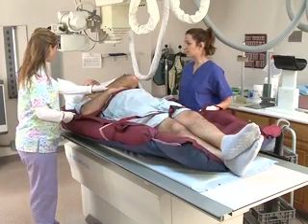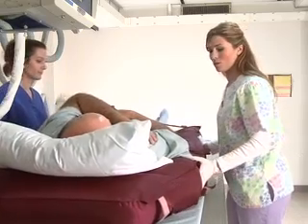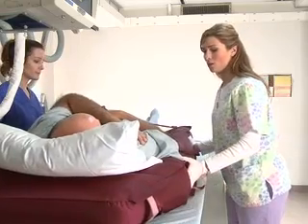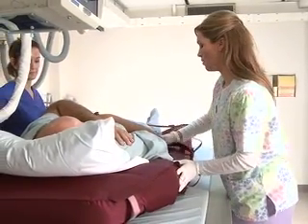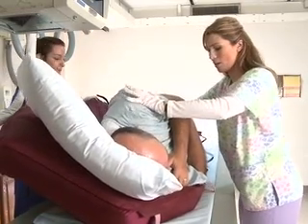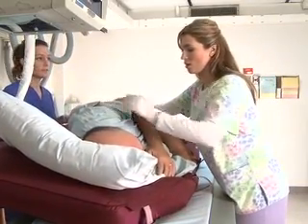The first step to the turning process requires the HoverMatt to be moved laterally away from the side to which they are turning. To do this, the caregiver on the side to which the patient will be turned uses an open-handed technique to push the HoverMatt, while the other caregiver grasps the handles to pull the HoverMatt. Stop when the side the patient will be turning onto is midline on the imaging table.